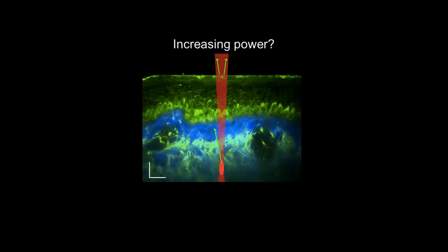Deeper than 100. It really depends. That's an approximate number. It really depends on the skin type we have, lighter or darker. We can penetrate deeper in lighter skin when we don't have the absorption from melanin, from the pigment in our skin. We usually image different lesions. We image skin cancer. So it depends on the lesion and how scattering it is. But that's pretty much a typical depth that we can penetrate in the skin. Go ahead.